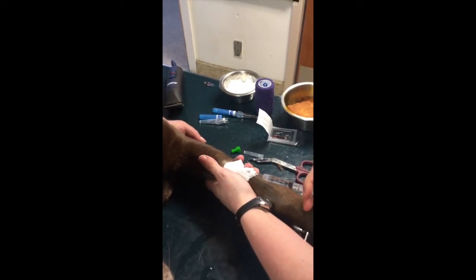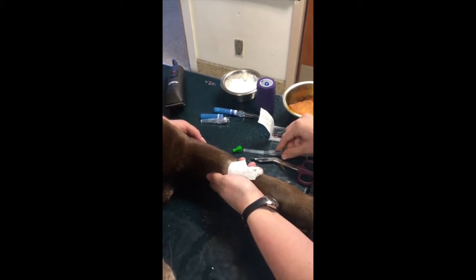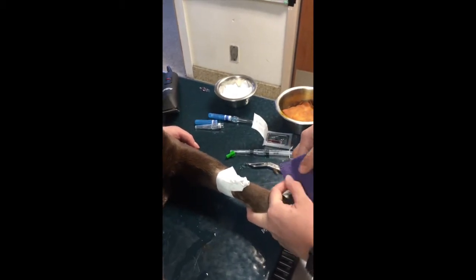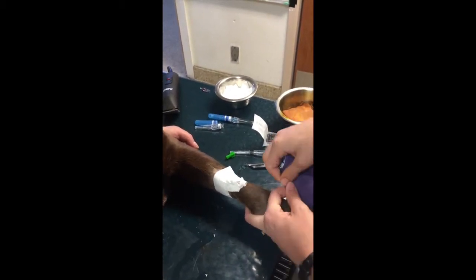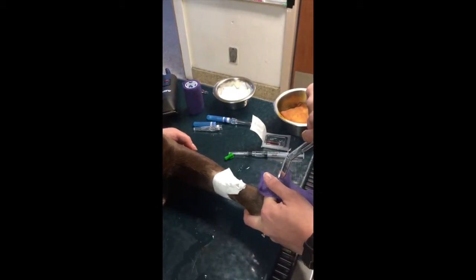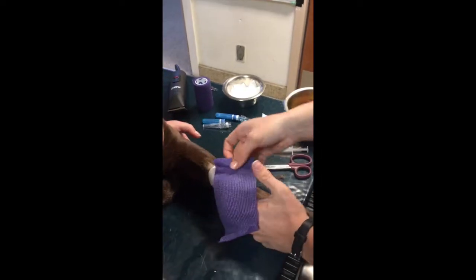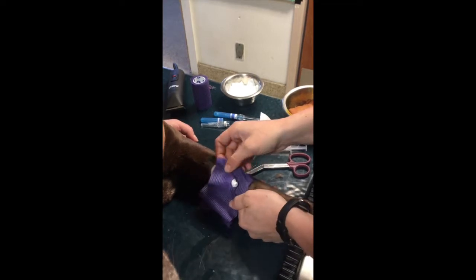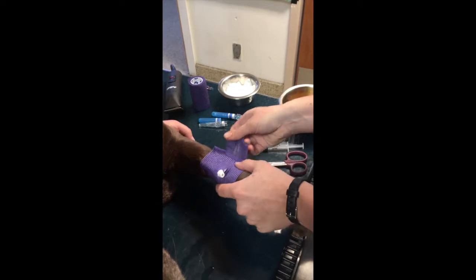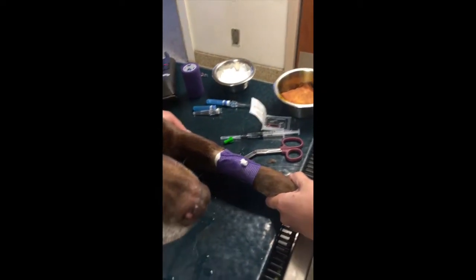I'm going to feel up here on. Alright, so the catheter is patent. The final step is I'm going to take some vet wrap and cover the entire catheter with only the injection port visible, so we can have easy access. It's okay. You're okay. Good boy. All right, and that is a cephalic catheter.